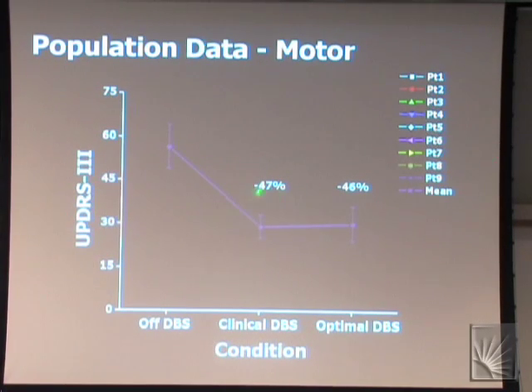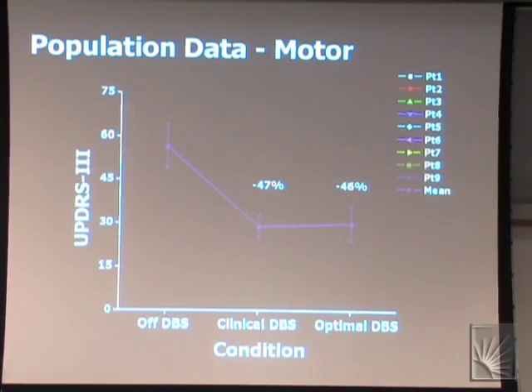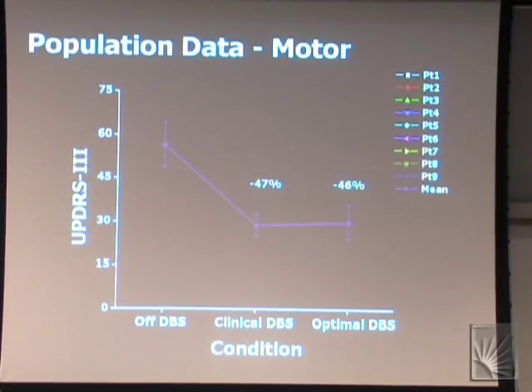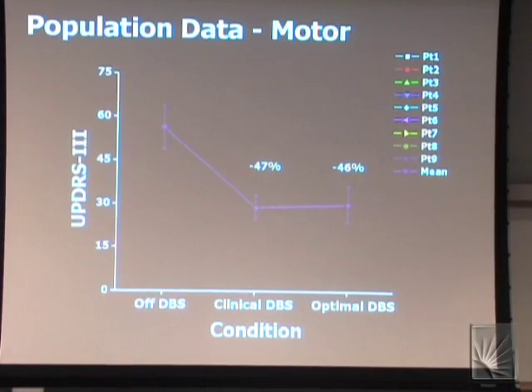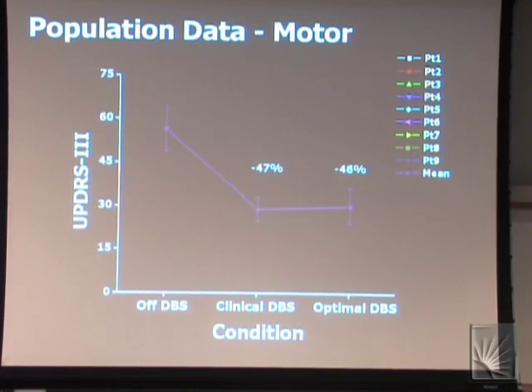But this clinical process, these were patients that were at least 6 months out in programming. And maybe Dr. Walter can talk with us afterwards, or give us a little idea of the total amount of time that goes into programming these patients. But published studies have suggested that this is tens of hours of time. This took a computer algorithm with no knowledge of anything about the patient.